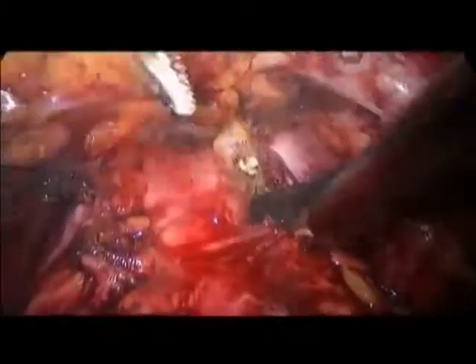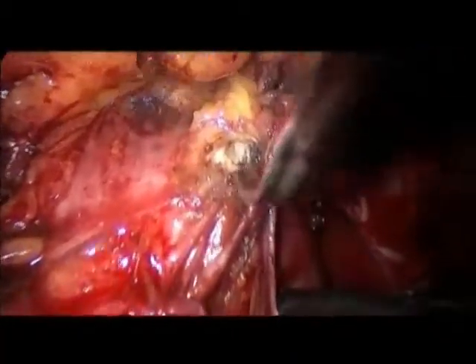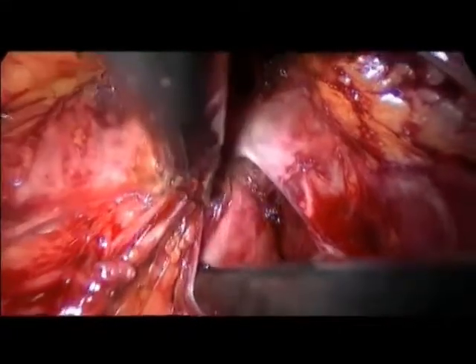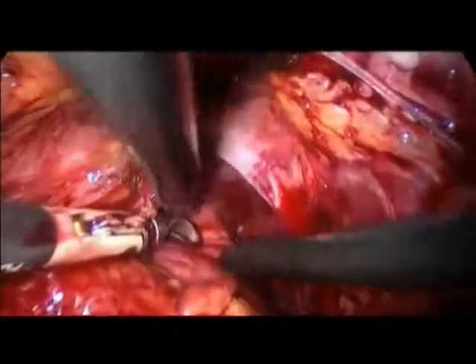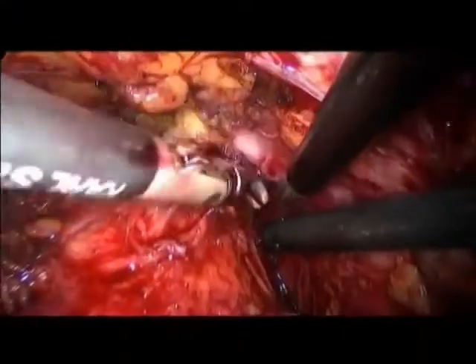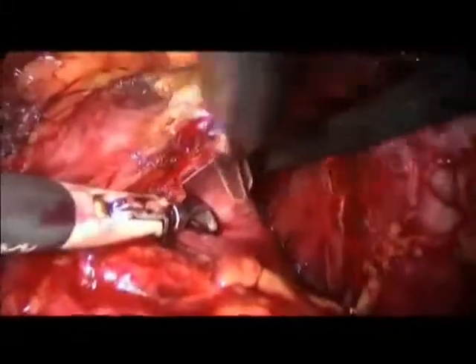Of course, when you start incising the puboprostatic, you are in a very close relationship with the surrounding veins of the Santorini, so that it may need some control. But otherwise, you can proceed. Most of these small venous bleedings are limited by the pressure of the pneumoperitoneum, so that you can proceed towards the apex.